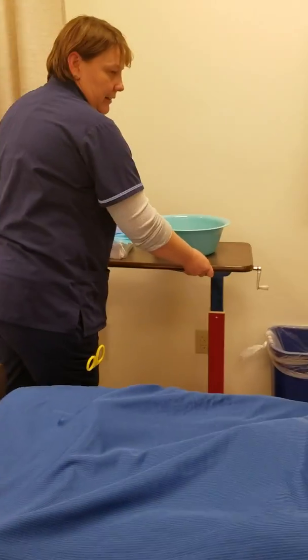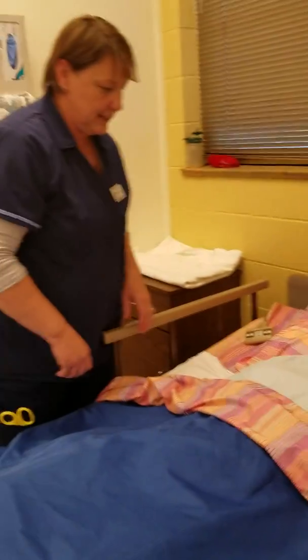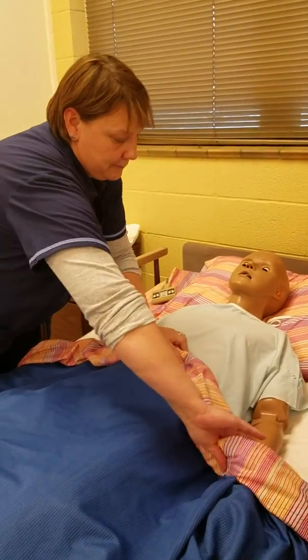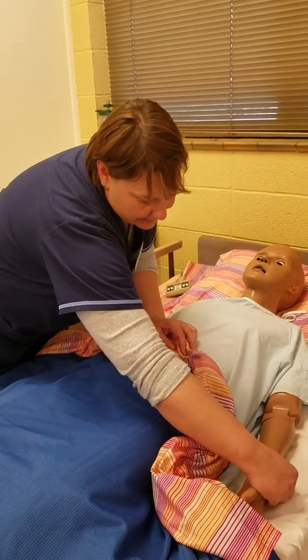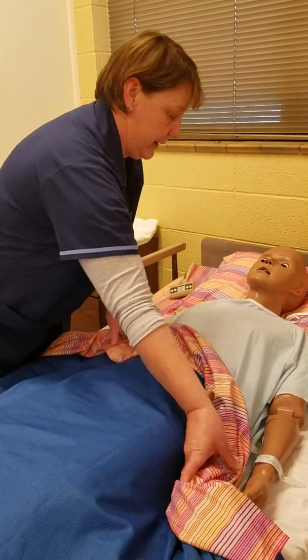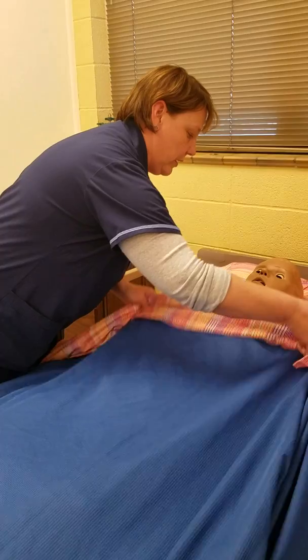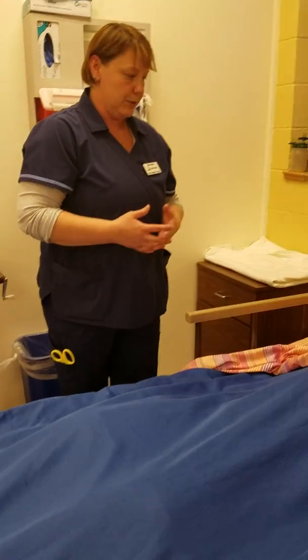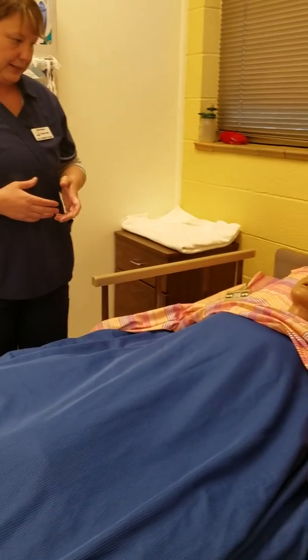Hi there, my name is Tawny and I'm a nursing student at MCC. Can you tell me what your name and date of birth are please? He tells me his name is Jose Cuervo and his date of birth is 9/16/95, and I verify that with the wristband. I also verify with the wristband that he has no allergy band, and I can confirm in his patient chart that he doesn't have any allergies.